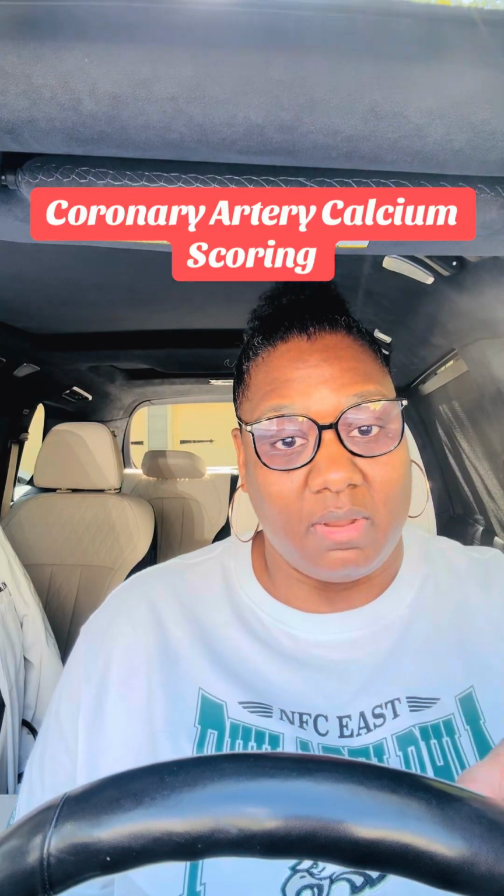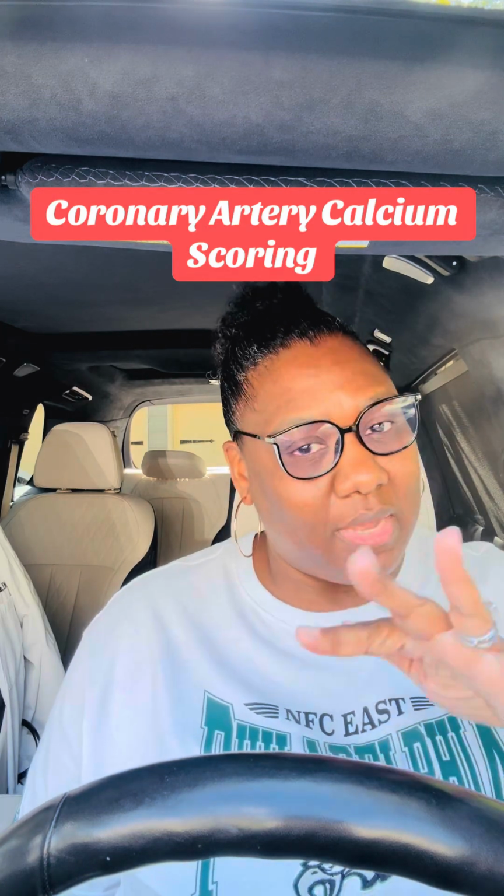What you should be aware of is that a calcium score in either one of the arteries or a total calcium score of 400 or so is usually indicative of a moderate calcium burden, moderate plaque burden.